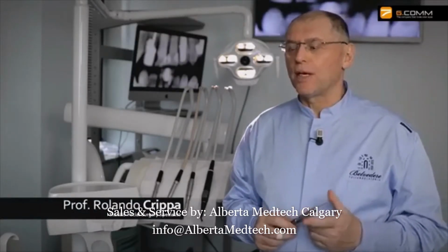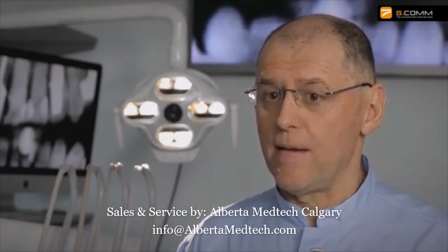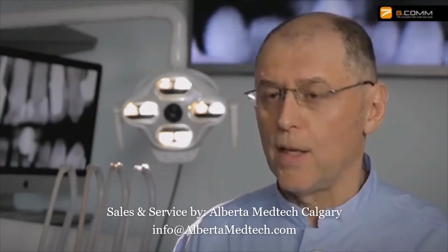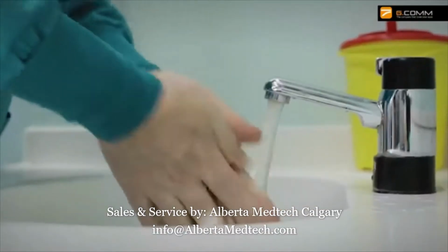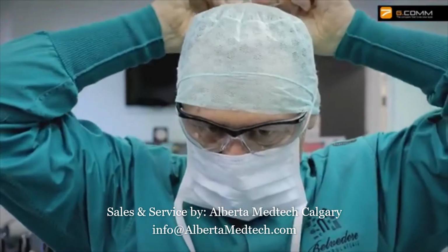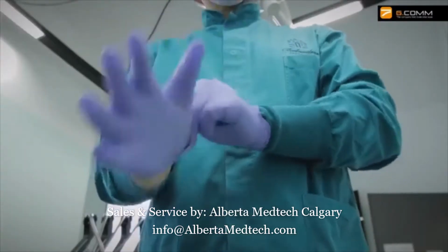Ideal workplace illumination is essential for both dentists and dental technicians, that which reproduces what we call sunlight. In practice, a well-lit workplace is one in which the dentist and dental technician's work is certainly made easier. This works in two ways. Firstly, for correct vision. Secondly, because incorrect lighting often induces fatigue.